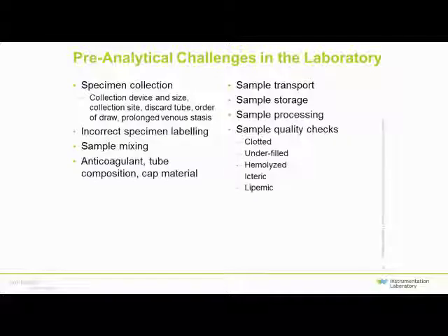It's important to know that not all pre-analytical errors cause adverse events, because many are caught, or they're minor enough that if undetected, they don't actually impact patient care. However, there may be unnecessary risk to the patient and unjustifiable cost to the healthcare system.